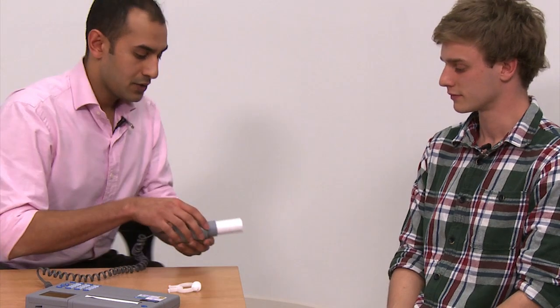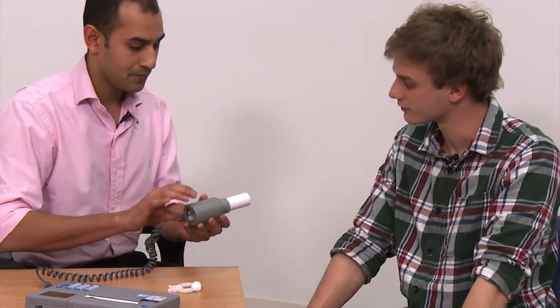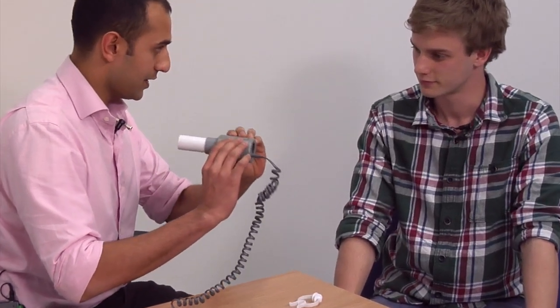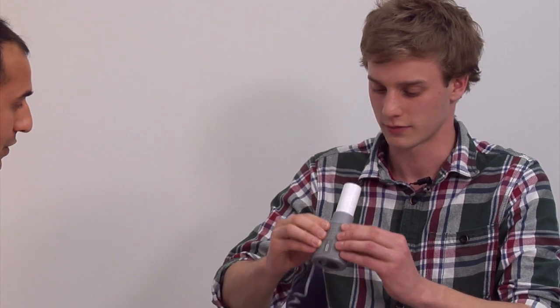So first I'd just like to show you how to use the mouthpiece. This part of the mouthpiece is single-use and will be thrown away afterwards. I'd like you to hold the mouthpiece like this and then put it in your mouth. Make sure you're not covering the hole with your tongue or your teeth, and then form a nice tight seal with your lips.